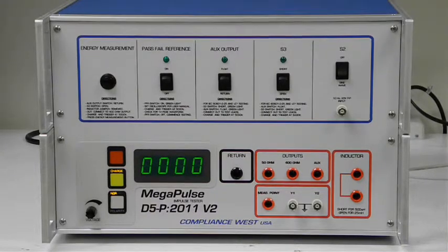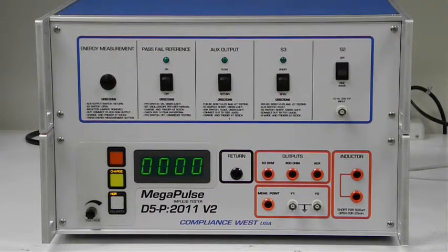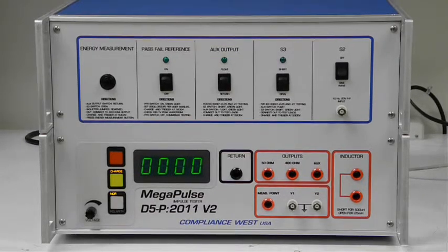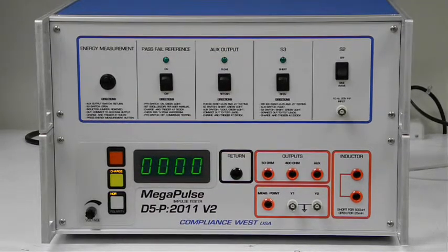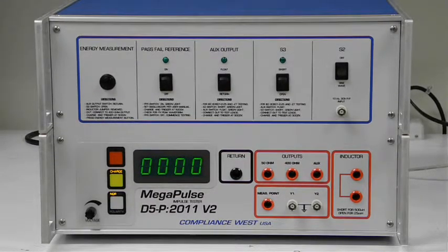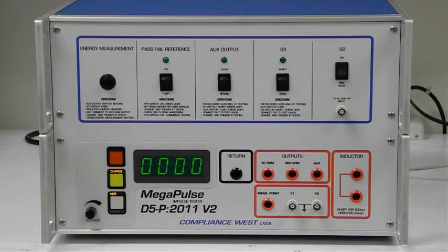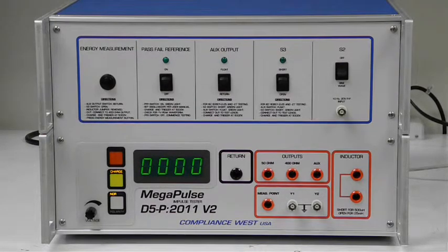The 100 ohm resistor is internal to the D5P 2011 V2, so this test is conducted by removing the connections to the 400 ohm and ground connectors on the front panel.